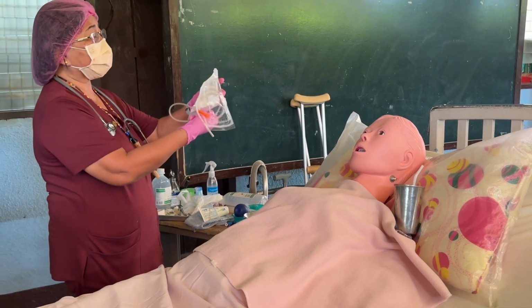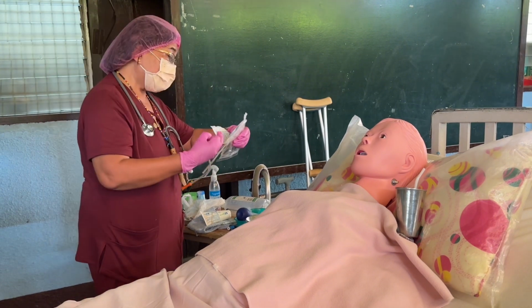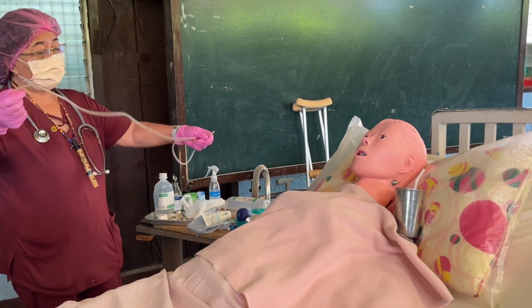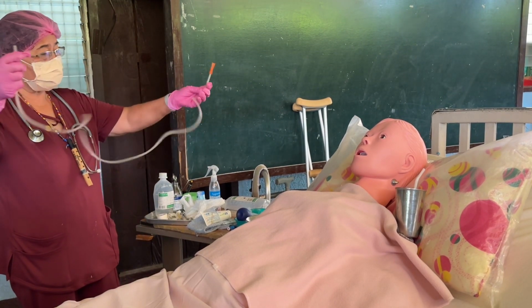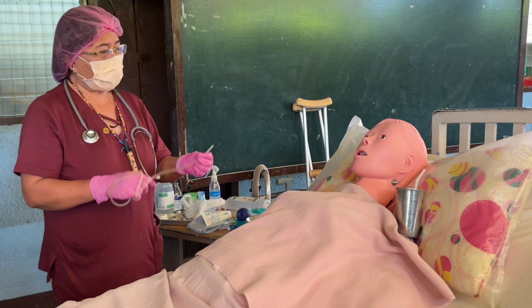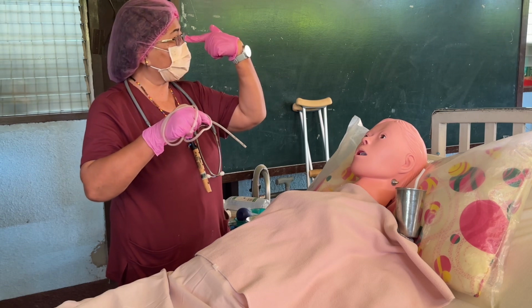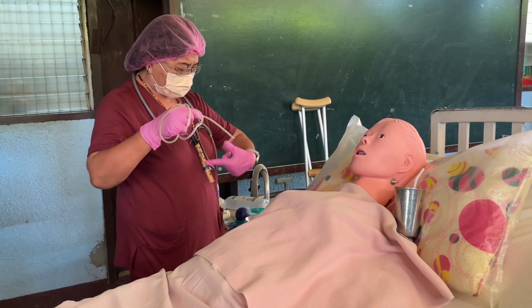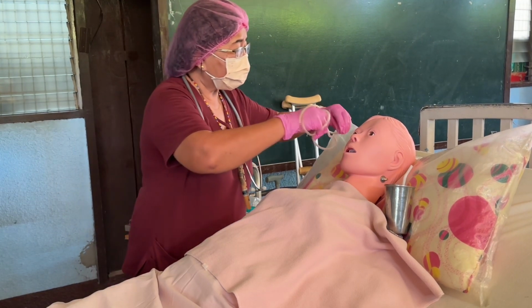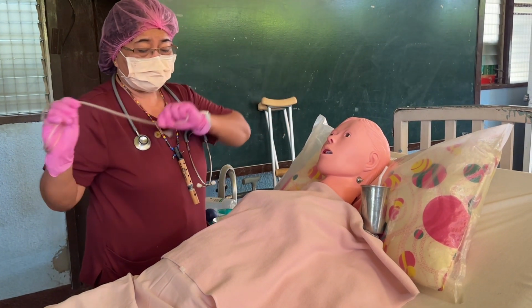So I've already checked the expiry date, the integrity, and any discoloration of the tube. French 18. So 18 is quite big, no? So after that, you check the integrity also of the tube. After that, now you measure the length from the earlobe to the bridge of the nose, bridge of the nose to the xiphoid process. In your advance, at least 1 to 2 inches below the xiphoid process. Okay? Earlobe to the bridge of the nose, then bridge of the nose to the xiphoid process.